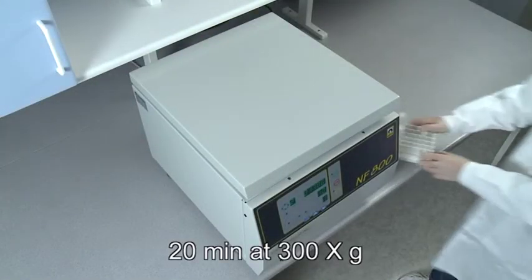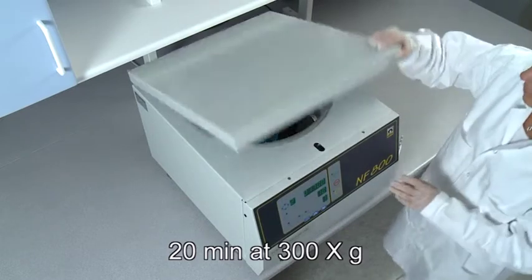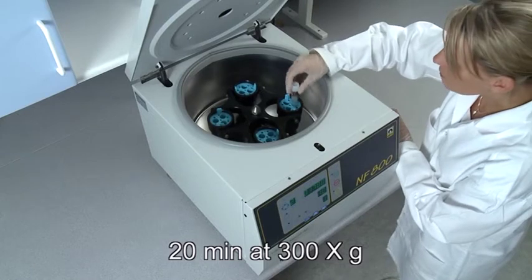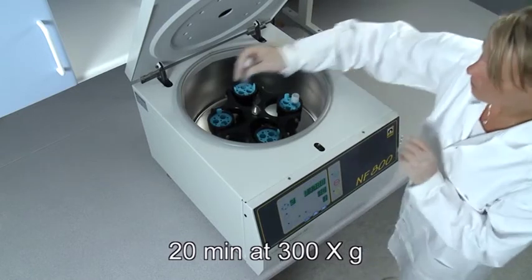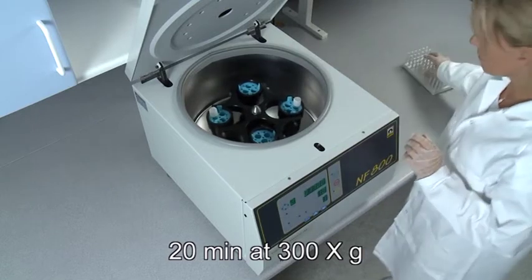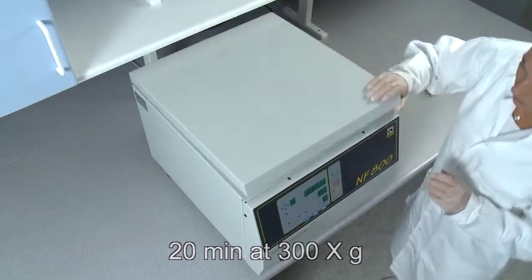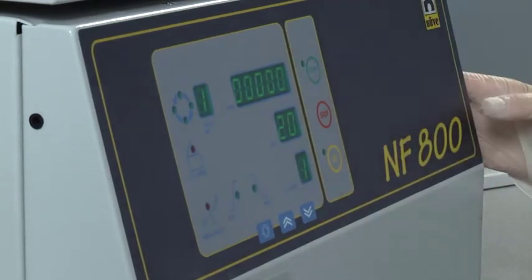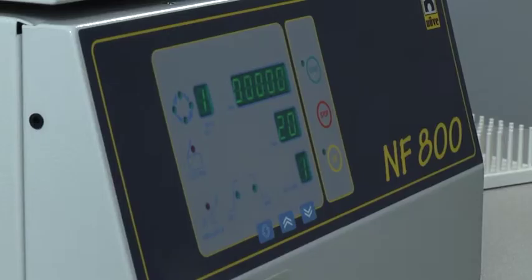Spin for 20 minutes at 300 times G in a centrifuge with a swing-out rotor. Do not use the brake. Be sure to calculate the correct rpm to give 300 G in your centrifuge by measuring the radius of the centrifuge rotor. Then use the equation found in the product manual on our website.